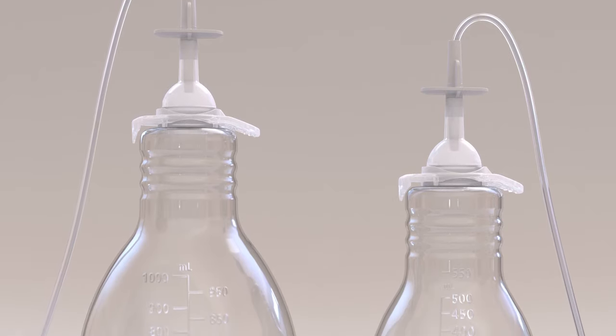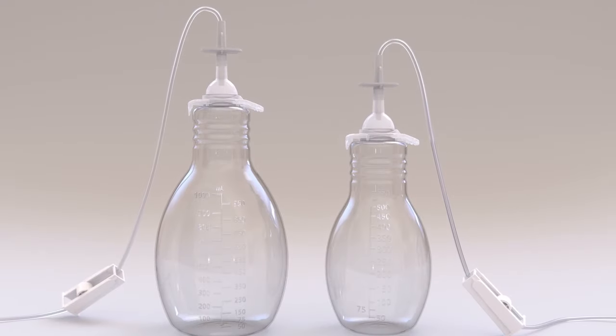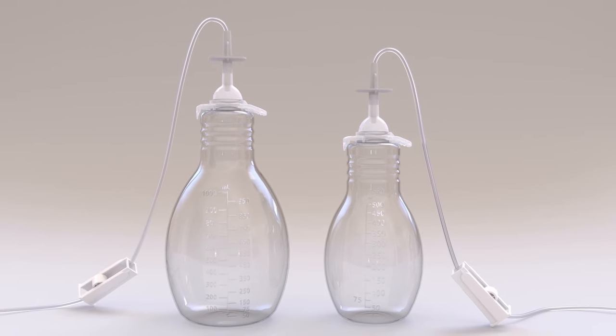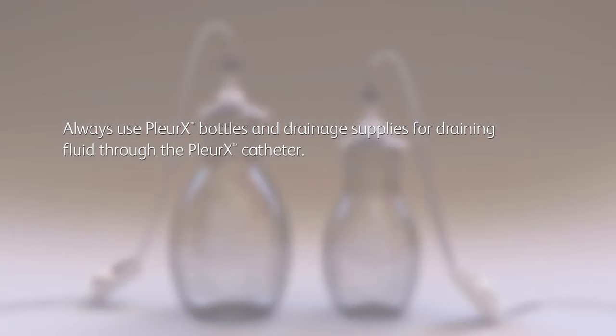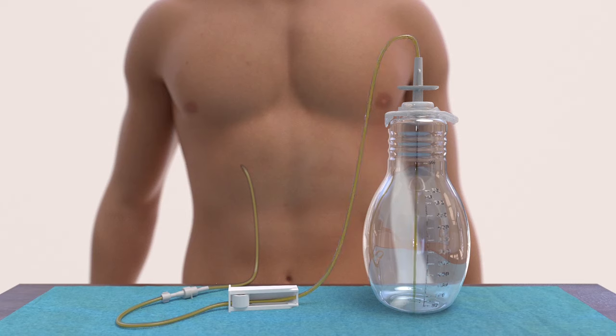You'll drain your fluid into Plurex drainage bottles specifically designed for use with your Plurex catheter. These bottles come in two sizes: 500 milliliters and 1000 milliliters. Preparation and use of each bottle is the same regardless of size. Always use Plurex bottles and drainage supplies for draining fluid through the Plurex catheter. The active vacuum technology in the Plurex bottles provides suction for drainage and allows you to place the bottle wherever it's most convenient during each drainage procedure.